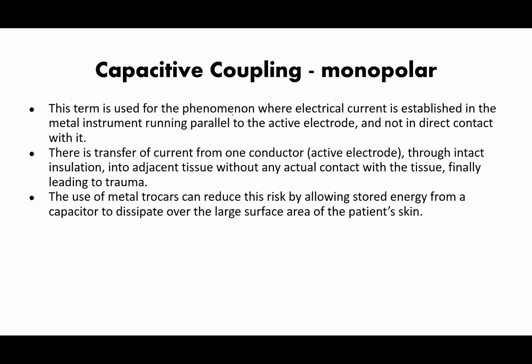There is a transfer of current from one conductor, the active electrode, through intact insulation into adjacent tissue without any actual contact with the tissue, finally leading to trauma. So that other instrument will now cause trauma.